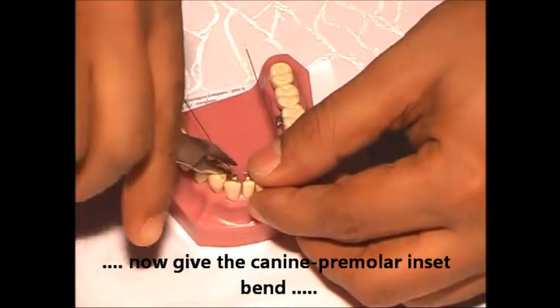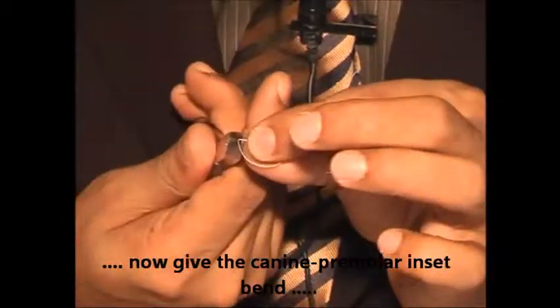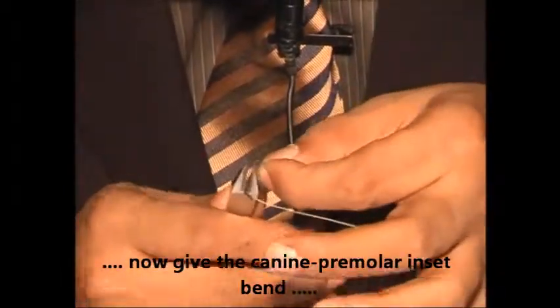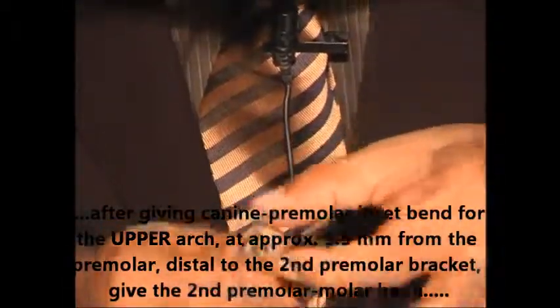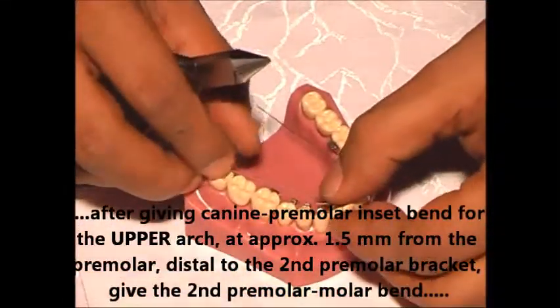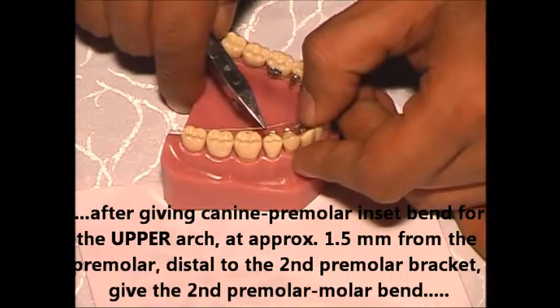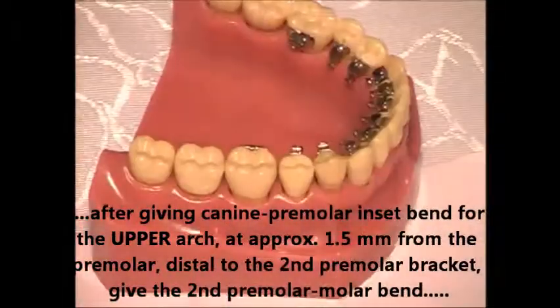You bend the canine premolar inset — that gives a canine premolar inset bend. One side I will make the bend for the upper arch and one side I will make it for the lower arch, the canine premolar inset bend. That is around 1.5 millimeters from the premolar distal to the second premolar bracket.